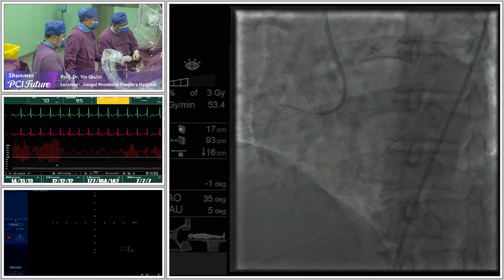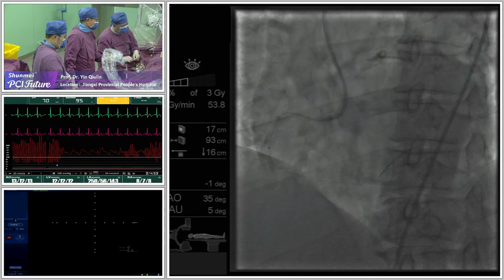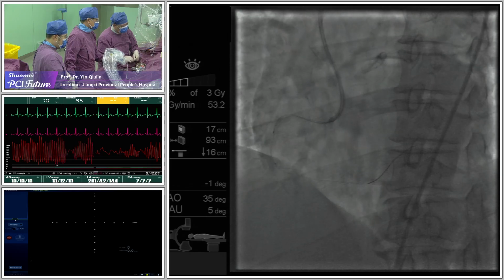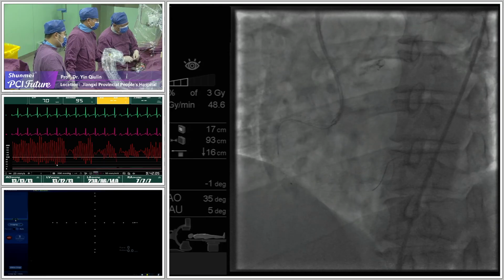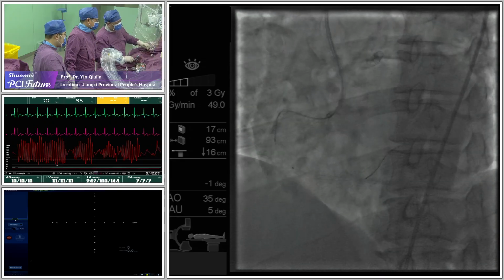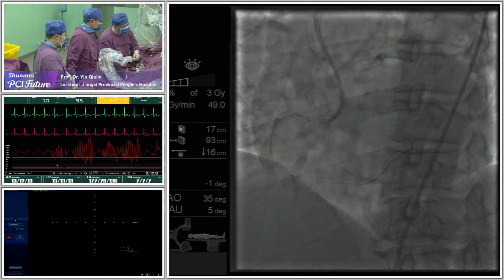Sorry, Dr. Young had to leave to the hospital. He has an emergency, but we're following you and we're looking at your setup shots. How to do this case, in your opinion? Antegrade or retrograde or ADR?